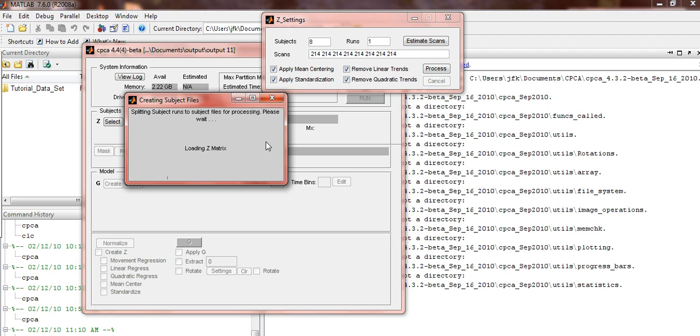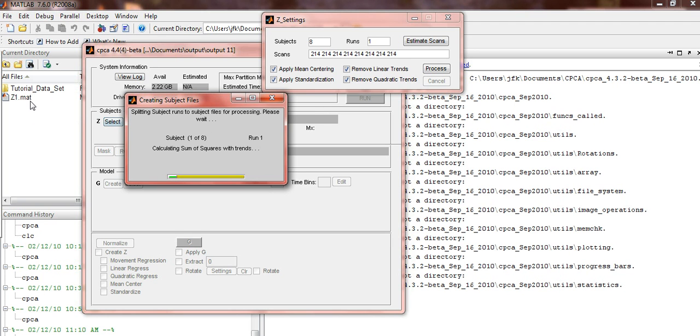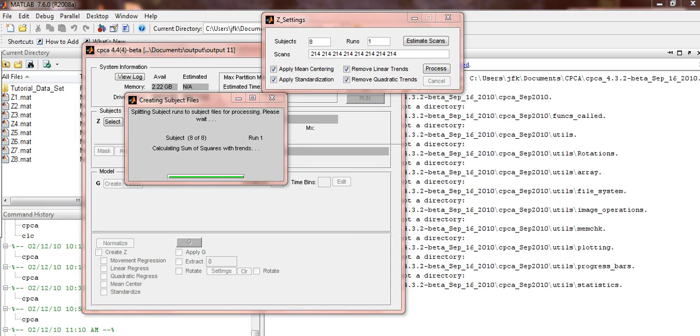A subject file will now be created for each of your 8 subjects. As they are created, you should notice them under the All Files list at the bottom of your screen.